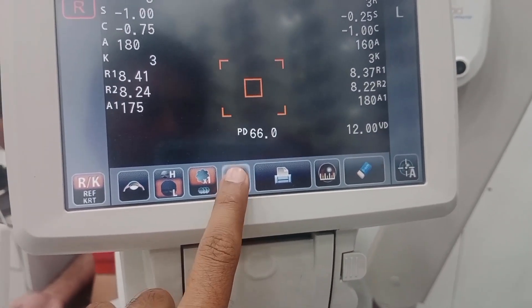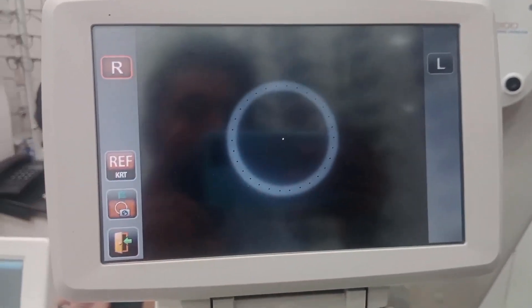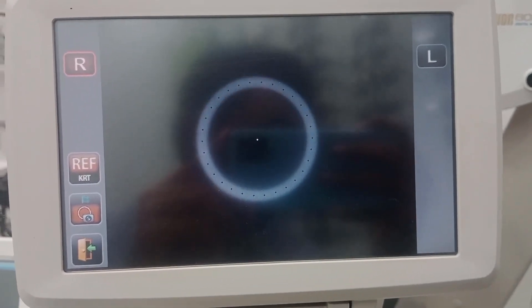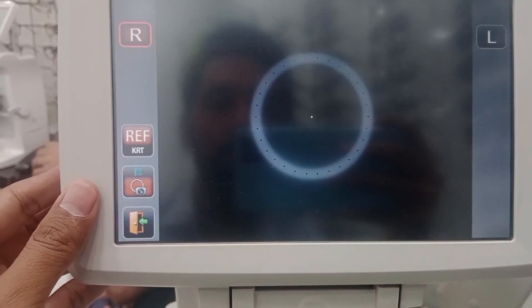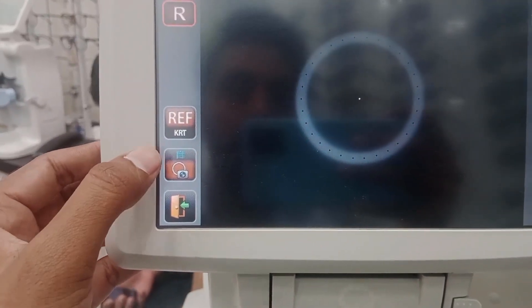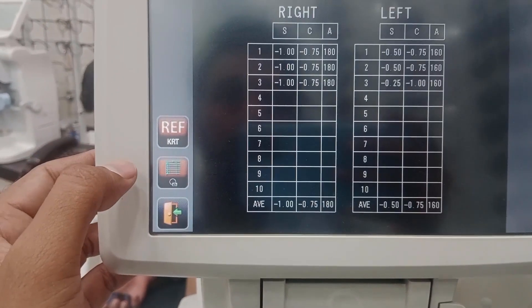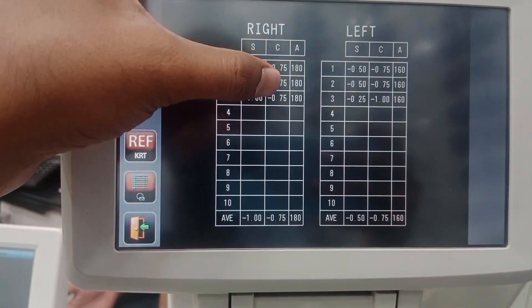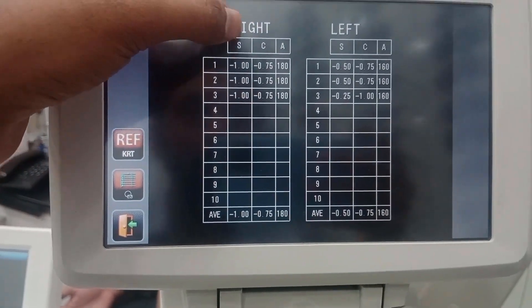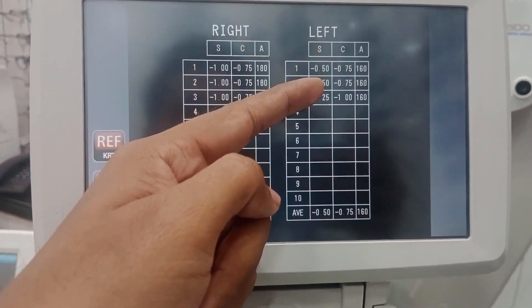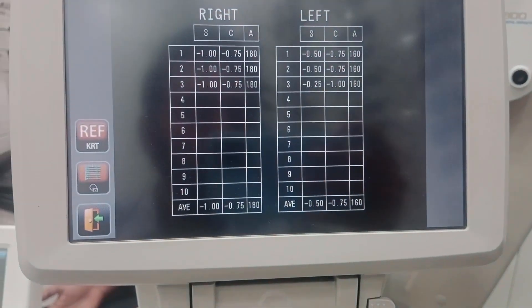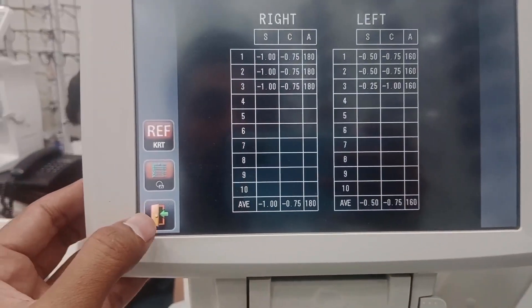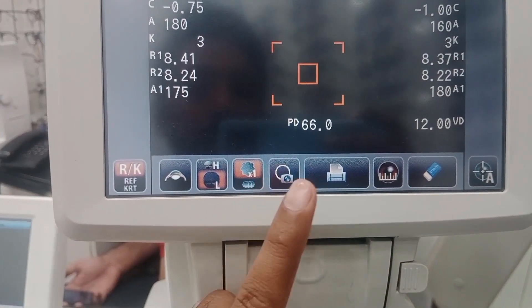The target button shows the dot exactly at the center of the cornea. Another setting shows the previous history of the recent patient — spherical, cylinder, and axis for the right eye and left eye, with averages below.